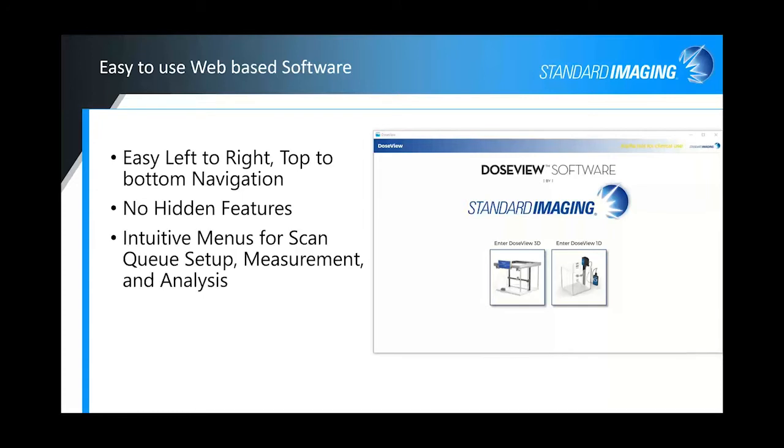And we have very intuitive menus for not only your scan queue setup, but your measurement and your analysis as well. And I'll run through that as I show you the software, just how easy it is to use.